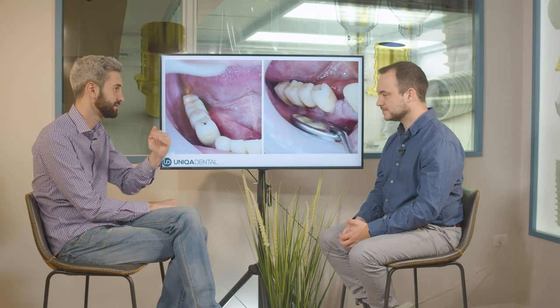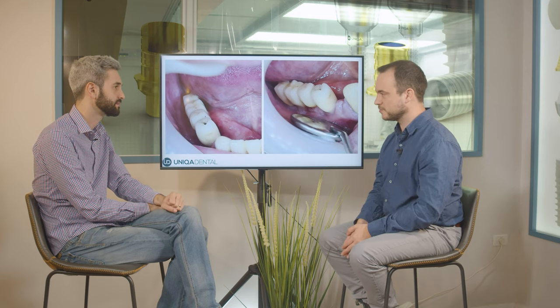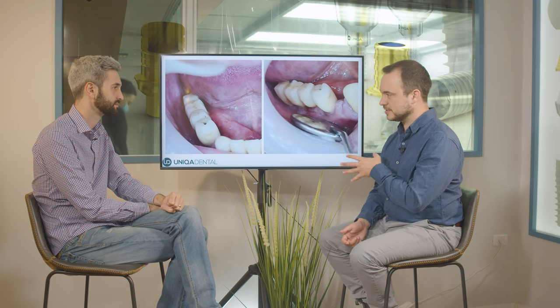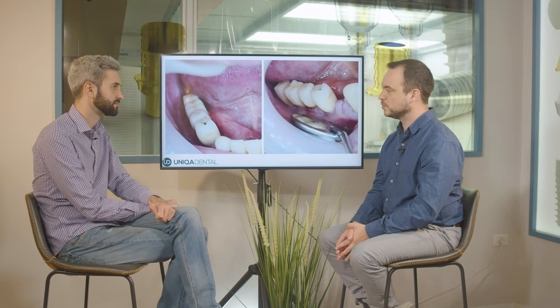So the crown will just be in the air — it will rest on the gingiva. Maybe there will be a little bit of space between the crown and the gingiva. This is the cantilever. For one premolar tooth, it's fine. It won't break because the forces are distributed. The occlusal part, if you don't make it too big, there won't be any problem.